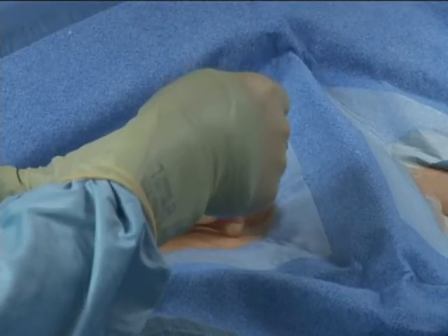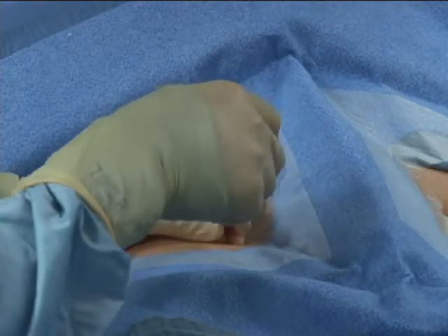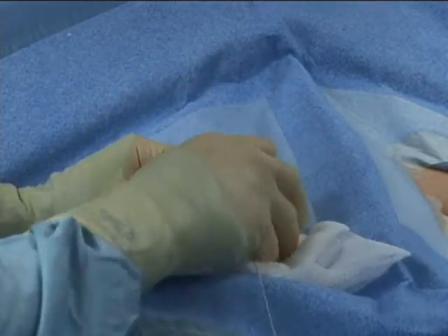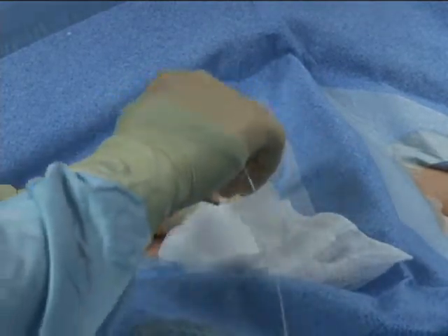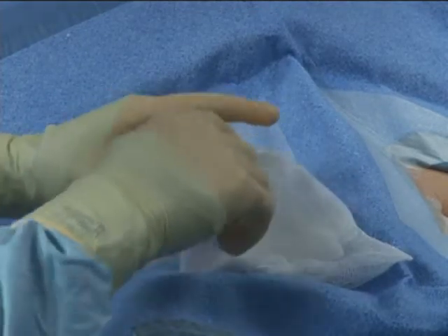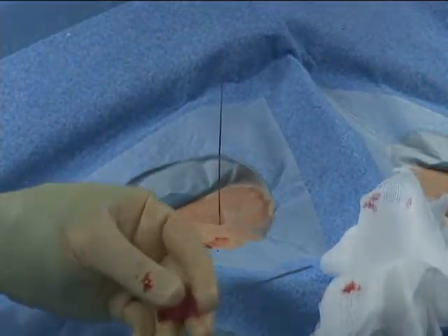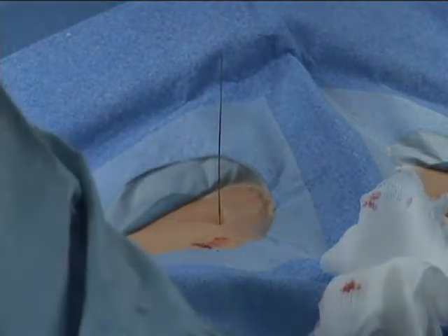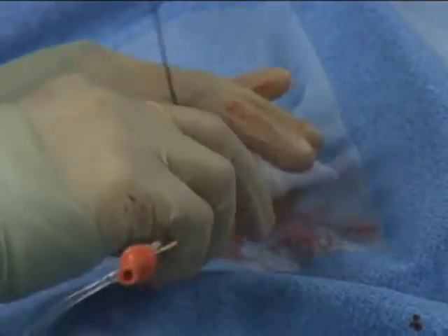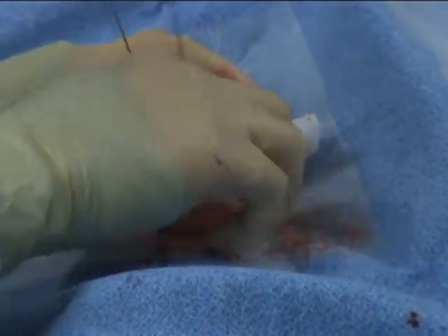After adequate local anesthesia has been achieved, the femoral vein is accessed using the modified Seldinger technique. 3 access points are obtained in the femoral vein, about 3 to 5 millimeters apart. Ultrasound guidance may be desired for venous access because it allows entering only the anterior wall of the vessel, reducing the likelihood of post-procedural hematoma. After the wires are placed in the vein, the sheaths are inserted over the wires and secured in position.